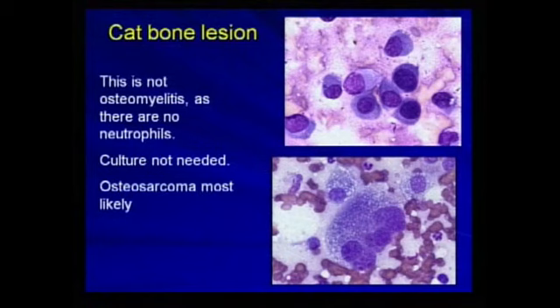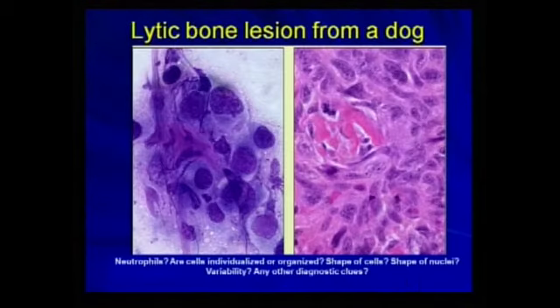Okay, I think that there may be some wisdom in leaving the door open a little bit. So I would certainly mention the possibility of a malignant plasma cell tumor as a remote possibility in the body of your letter.